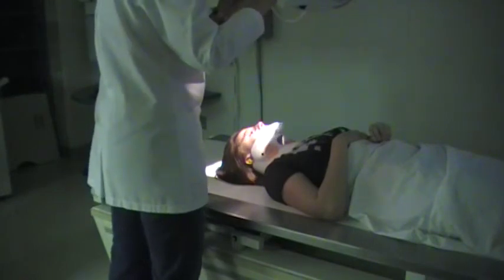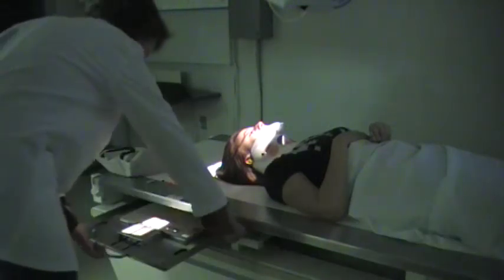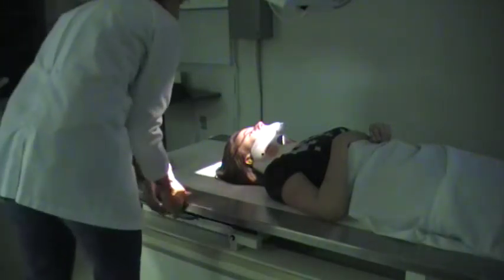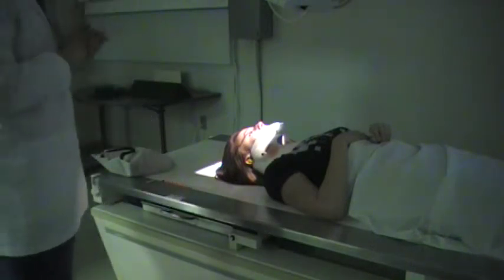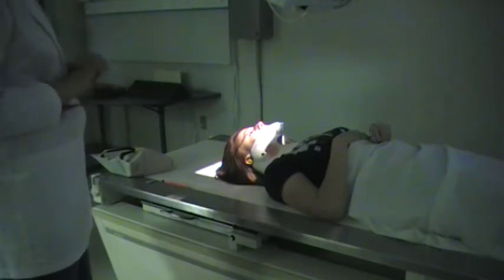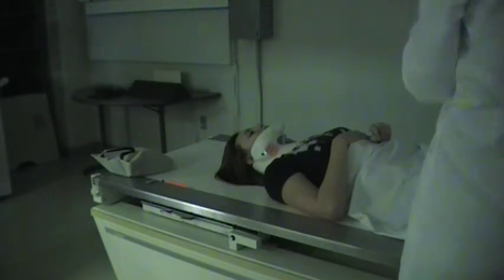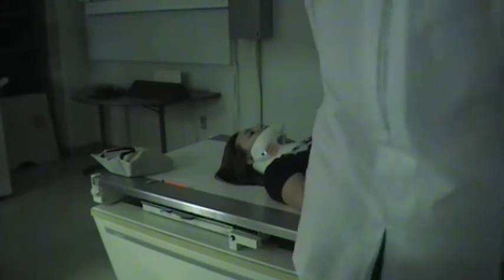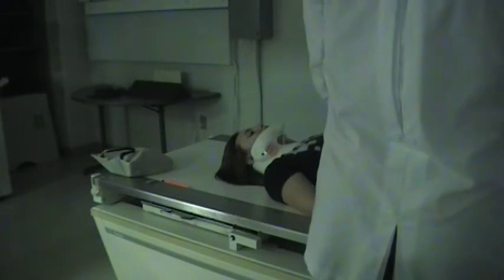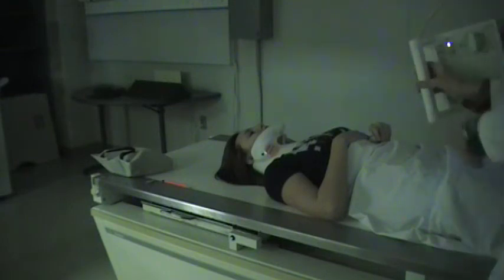The central ray is going to enter at the nasion, and then go ahead and line up your Bucky tray so that all of it will be in alignment. Next I'm going to do the SMV for the zygomatic arches. So I'm going to pull the x-ray tube down to about a little past midway. It's really closer to the patient's femurs. I'm going to lower it down and then angle the tube so that it's projecting towards the face.